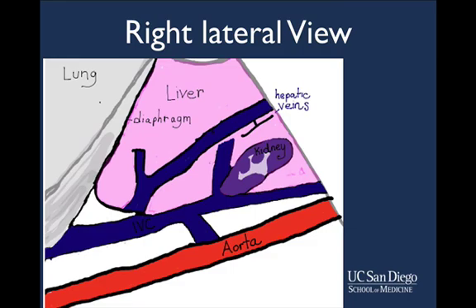And this is a diagram of what we will see. Superiorly, we will see the lung and the diaphragm. As we fan from posteriorly, we will see the kidney first, then the aorta. As we fan more anteriorly, we will see the inferior vena cava, giving off the hepatic veins to divide the liver into its anatomic lobes. As we fan even more anterior, oftentimes we can identify the thicker-walled portal veins.